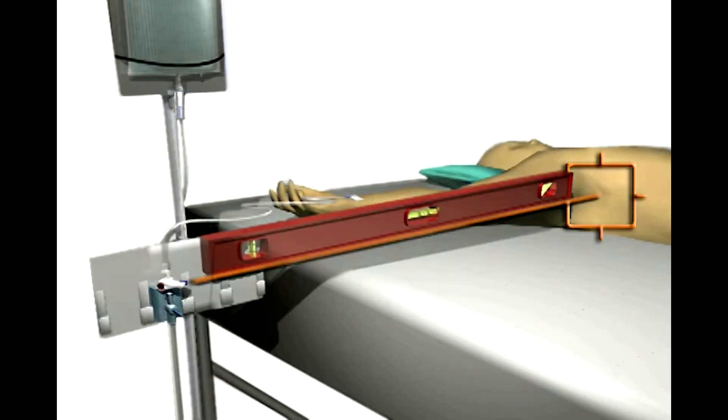Step 2: For intravascular pressure monitoring, level the transducer to the patient's phlebostatic axis, which can be found at the midpoint between the anterior and posterior chest wall at the 4th intercostal space. It is important to maintain the level of the transducer with the phlebostatic axis at all times while monitoring to ensure accurate pressure readings.